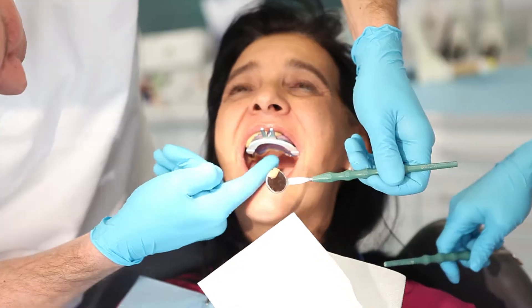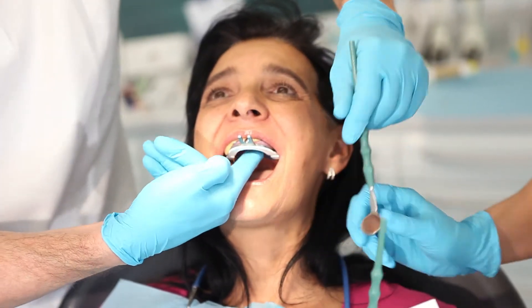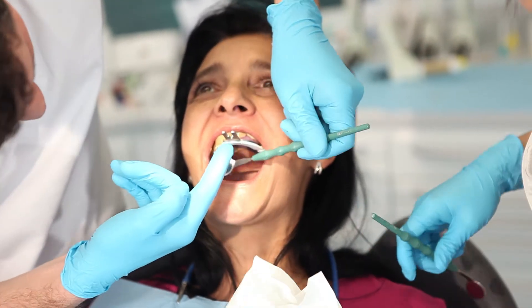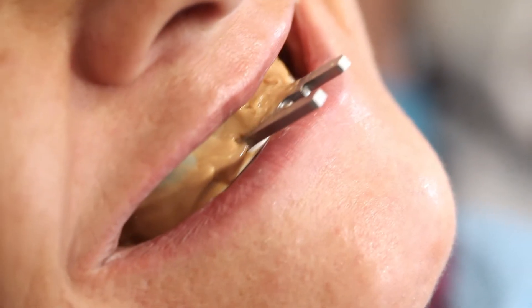Ask the patient to suck on your finger again. This allows you to determine if impression material is still flowing towards the throat. If this is the case, remove it. The next steps are carried out in the same way as those for taking the impression of the functional margin.